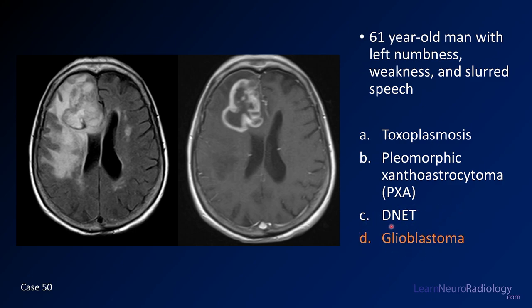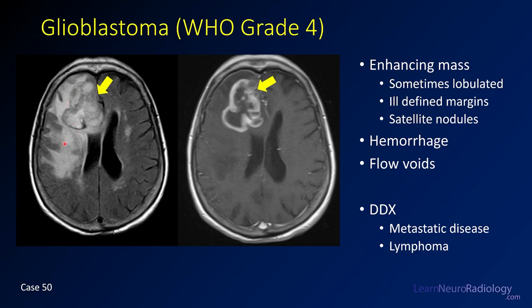This is a classic case of glioblastoma. What you have is a frontal lobe mass with a lot of edema and white matter abnormality extending through the genu of the corpus callosum. On post-contrast, there's peripheral enhancement with central necrosis — classic appearance of a GBM. You can have hemorrhage and flow voids associated with these. The differential is metastatic disease or lymphoma; if you see more white matter infiltration, think GBM. Lymphomas tend to be more solidly enhancing, particularly in immunocompetent patients.